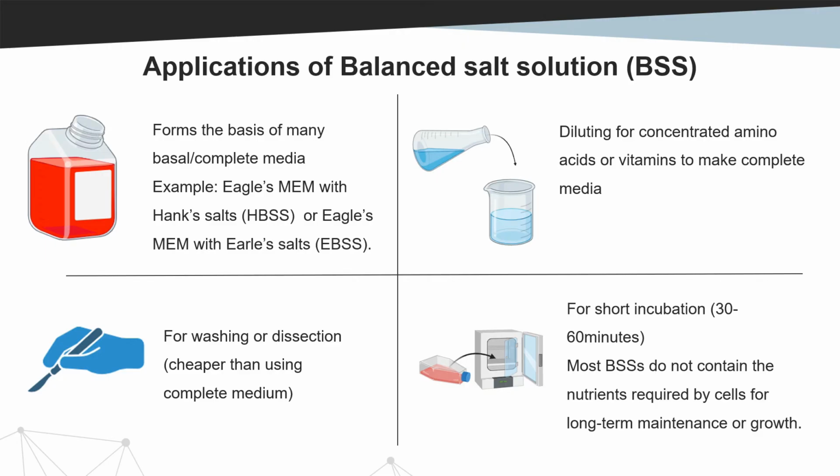Since most balanced salt solutions do not contain nutrients required by the cells, of course they cannot support long-term growth or maintenance of the cells. So you can do short incubation in your experiments. And lastly, you can use it for washing or dissecting of your tissue samples or your cell samples because they are definitely way cheaper than using a complete medium.